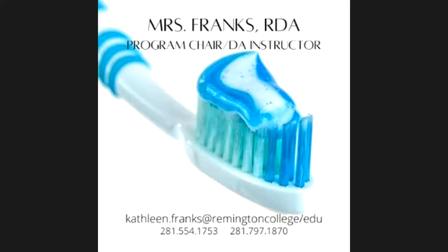I remember when we did the X-rays with Dr. O. That was my main problem. It was either I was getting the tooth too long or too short. Right. And the thing you have to remember is that even if you use that XCP and the aiming ring, it's not always right. We get too dependent on that aiming ring, because you always have to remember that it's always about being perpendicular to your film, right? Eventually, I should be able to take that aiming ring away.